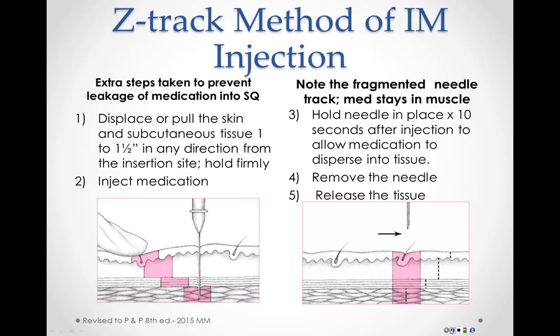The Z-Track method is an IM injection technique that prevents leakage of the medication from the muscle into the subcutaneous tissue. It can be used for all IM injections, but it is most important to use this technique when giving an irritating or a painful medicine.